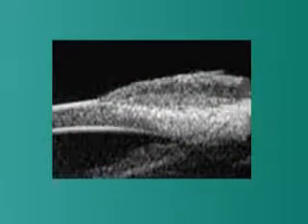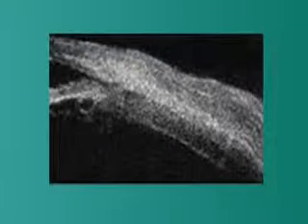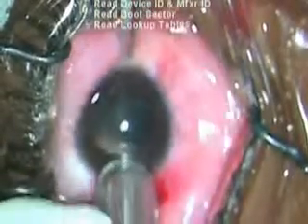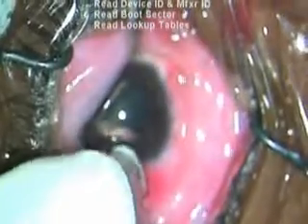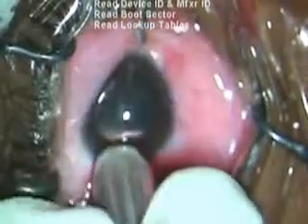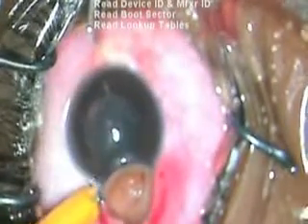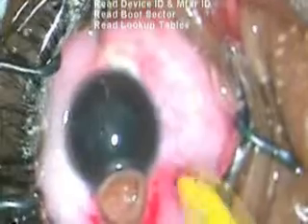A detailed preoperative evaluation included gonioscopy and ultrasound biomicroscopy. A conjunctival peritomy surrounding the conjunctival side of the lesion was performed with Vannas scissors. The smallest trephine that would completely surround the lesion was chosen and used to make a partial thickness cut. The vertical edge of the dissection was kept perpendicular to facilitate donor tissue placement.